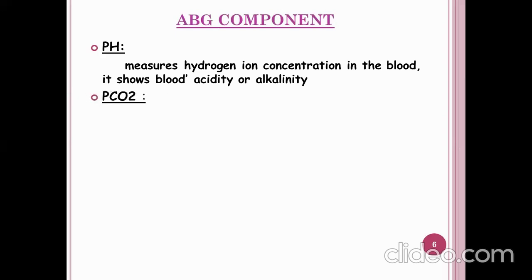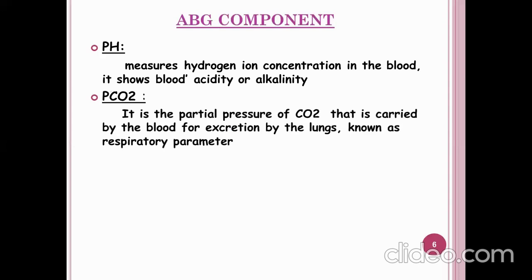So another one is the partial pressure of carbon dioxide, PaCO₂. It is the partial pressure of carbon dioxide that is carried by the blood for excretion by the lungs. That means the blood carries the respiratory gases for excretion with the help of the lungs. So that is known as a respiratory parameter.